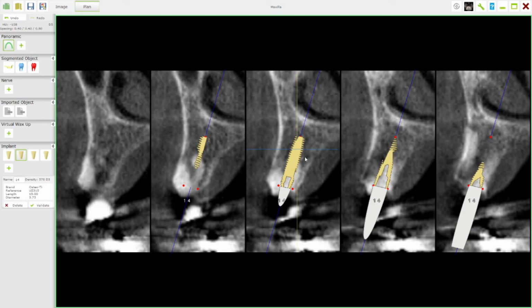So if you had 5 steps or 5 drills, pilot, and then 3 or 4 sizing burrs, you may decide to drop down 1 sizing burr rather than over prepare the osteotomy and end up with poor primary fixation. With the system that we use, in a D4, D5 situation, really we would be advising just to use the pilot burr and 1 other sizing burr, and not to really go any further up the sequence of drills in order to maximize primary fixation.